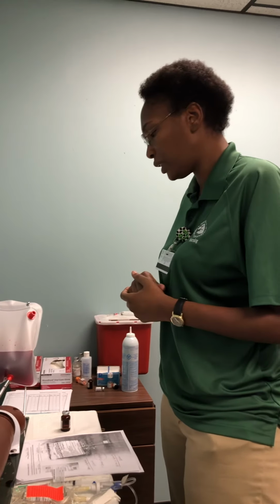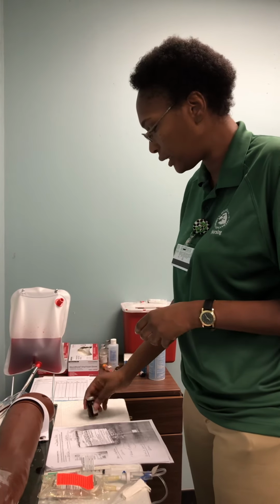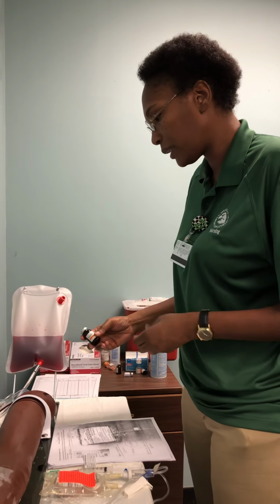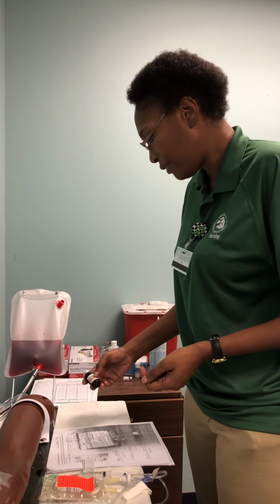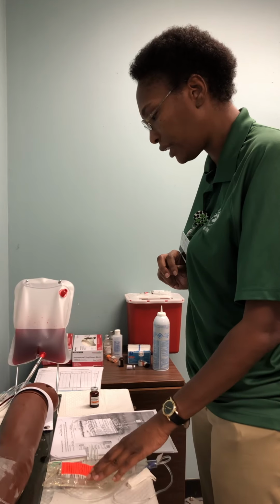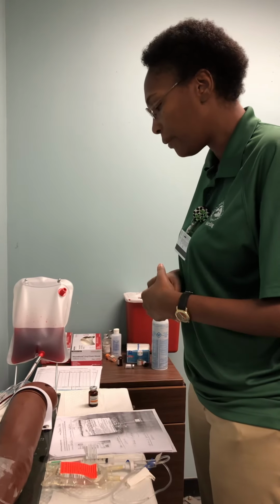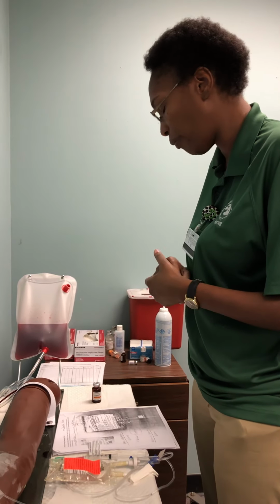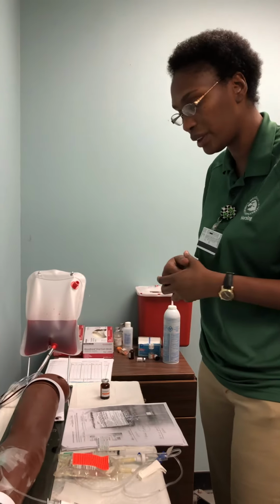Hello, my name is Demetria. I'm going to be your nurse today. I'm going to give you Lasix, 30 milligrams, because you've been retaining a lot of fluid and have a lot of edema, by IV push. And I'm also going to give you gentamicin, 60 milligrams. It's an IV piggyback antibiotic that I'll hang because you're having some infection going on. Do you have any allergies to any medicines? My patient doesn't have any allergies.